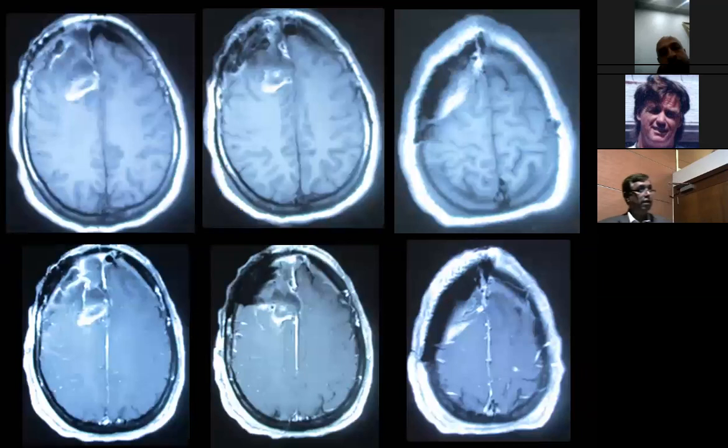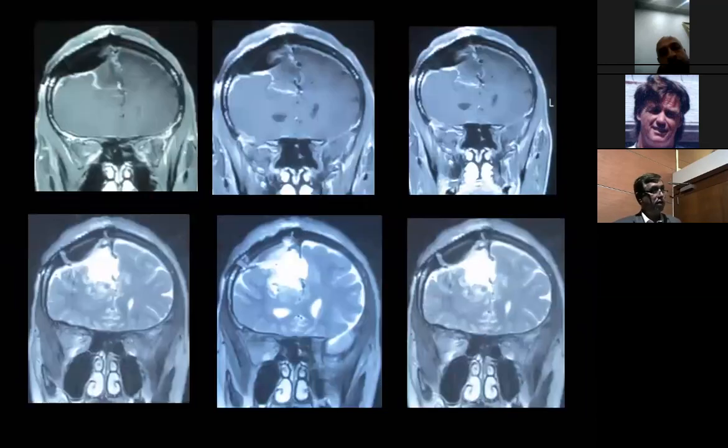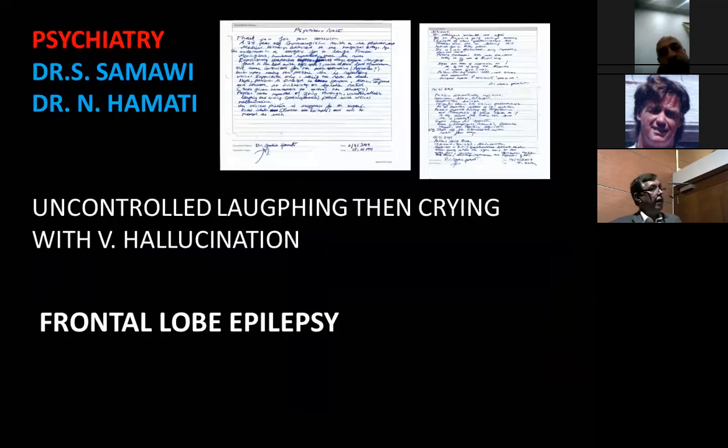And this is the immediate postoperative. These are postoperative changes. There was no tumor left whatsoever. She developed some psychological problems.